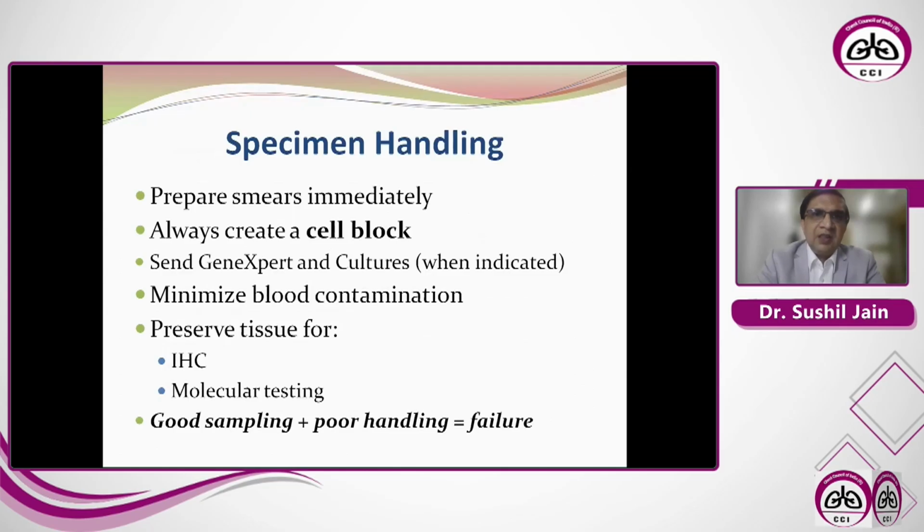Specimen handling. Now, about specimen handling, we'll have another lecture after me, but let me just give a brief about it. When you are preparing the sample, make sure that you prepare smears immediately. Always create a cell block. Send GeneXpert and cultures when indicated. Minimize blood contamination and preserve tissue for IHC and molecular testing. So you need to handle the tissue well.